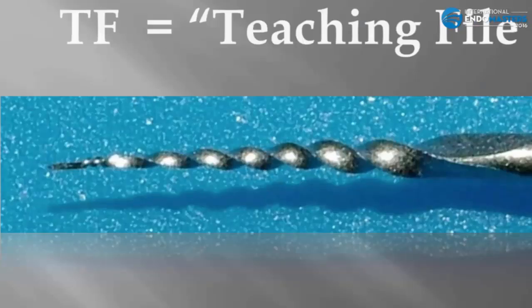The TF can show a unique tendency to coil when the tip is blocked as a result of improper clinical use. These findings should be considered a safety feature which absorbs stress, prevents failure, and informs the dentist where the problem is located.